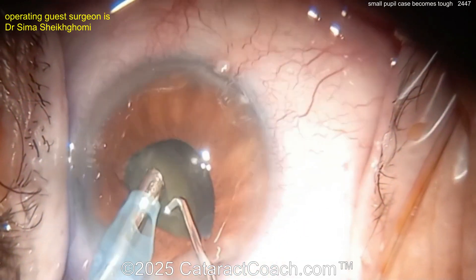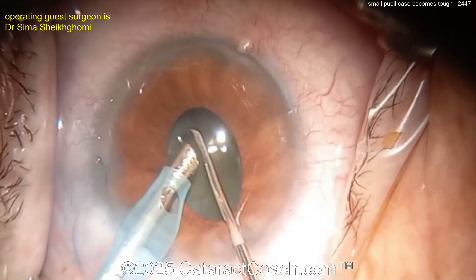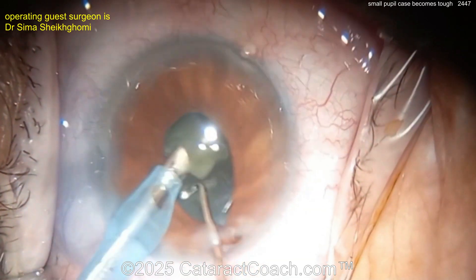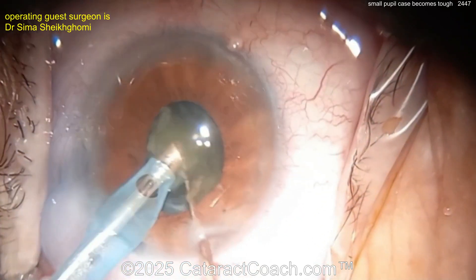For a case like this I would do a large rhexis, five to five-and-a-half millimeters, and prolapse the nucleus partially through the capsular bag opening and partially into the anterior chamber, held by the pupil. That gives you a large pupil and easy access to get the whole nucleus out.